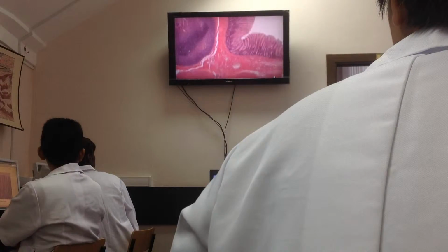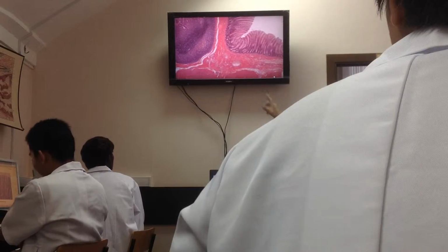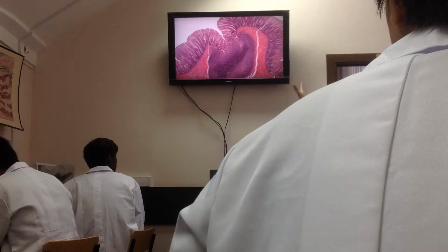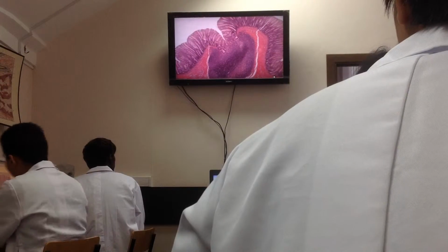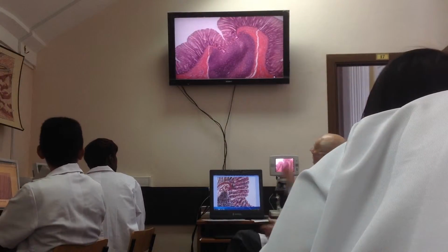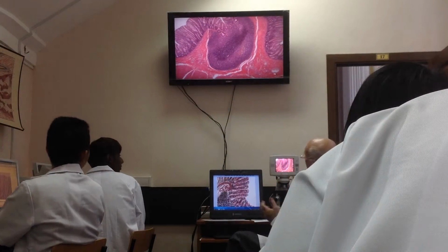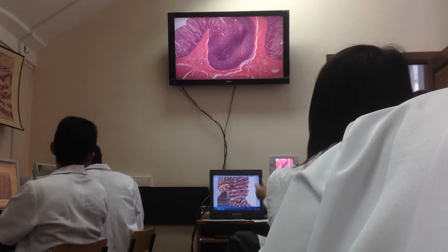Evaginate. And then the submucosa, its thickness is the same. So, in this region, the submucosa evaginates. What structure do you see now? Evagination of submucosa. It's a plica. And in the submucosa, in the connective tissue, besides blood vessels and nervous plexuses, if a nervous plexus is present in this section, we will see this structure.